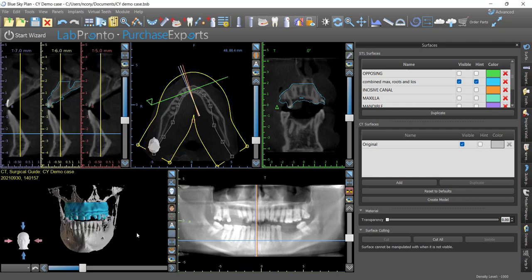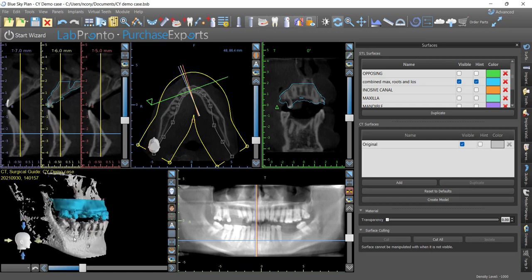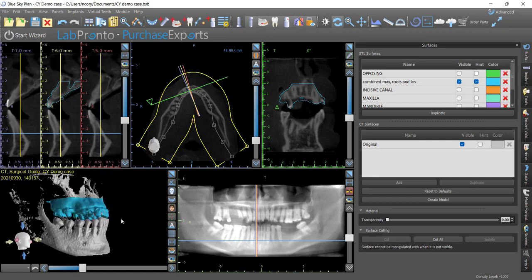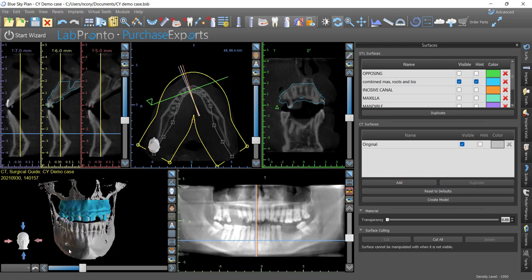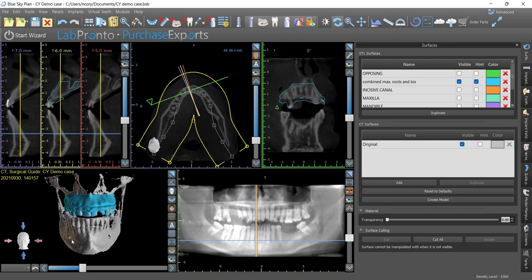Hey, what's up? This is Dr. Corey Glenn with LewisGuyBio. I'm going to show a complex upper full arch case that I'm going to be doing for a doctor. We're going to be making stackable guides. The goal is to do upper hybrid, with lower dentition in decent condition. In this video, and continuing in further videos, I'll show how I go about setting up the wax up and figuring out where we're going.